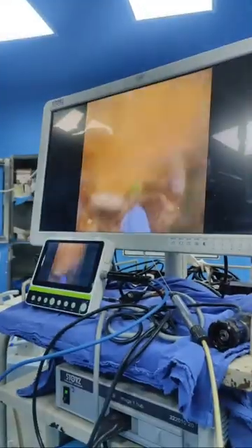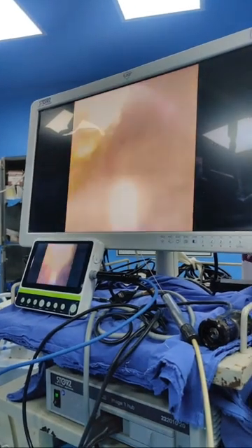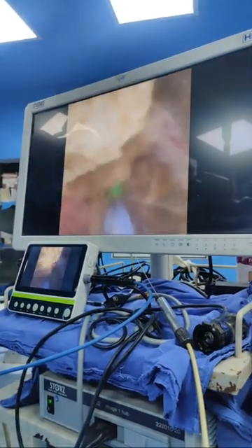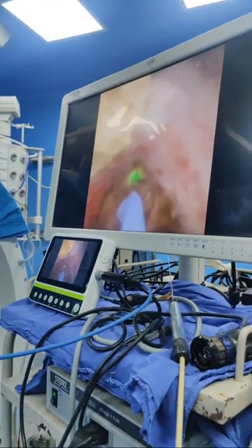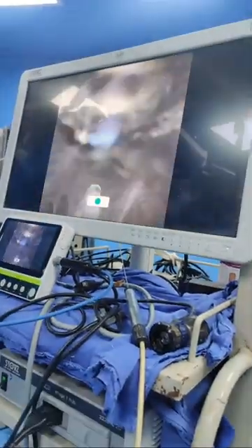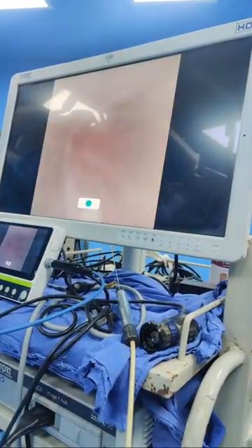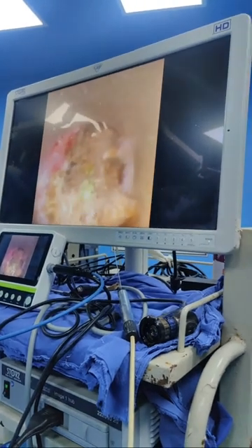When that fragment is there, you just have to withdraw the nephroscope so that it comes out. The bigger stone fragment going by the side of the nephroscope might not allow the movement of the scope in the sheath. This is how we suck the stones out. So now all the small stones which were there, multiple, have come out.